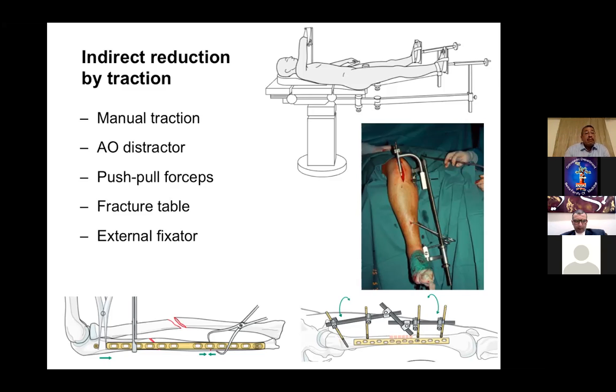You may get this needed traction manually by having an assistant who can do traction the whole time of the surgery, or you can use some tools that will help you and save an assistant, like the fracture table, the femoral distractor, the external fixator as a temporary reduction tool intraoperatively to keep the fracture in the reduced position, and the push-pull technique in order to reduce the fracture like we see here in the diagram on the left side below.